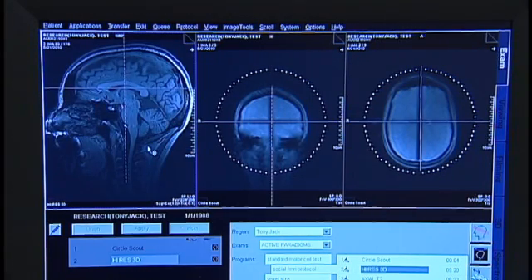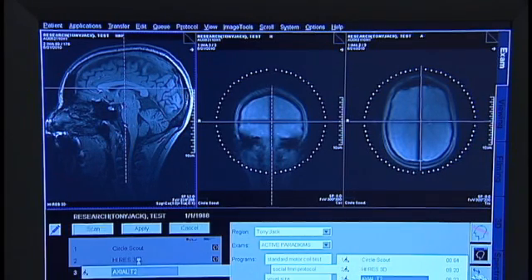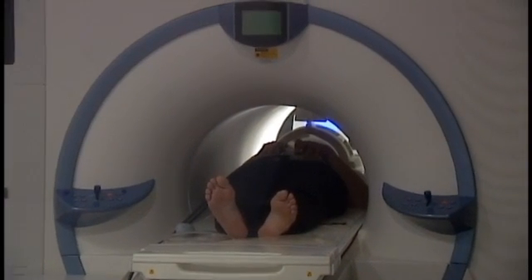A series of scanner sequences is used to collect images. First, a localizer scan is used to make sure the participant's head is placed in the center of the field. This is important for image quality. The participant may need to be removed and head cushions adjusted to ensure good head positioning.